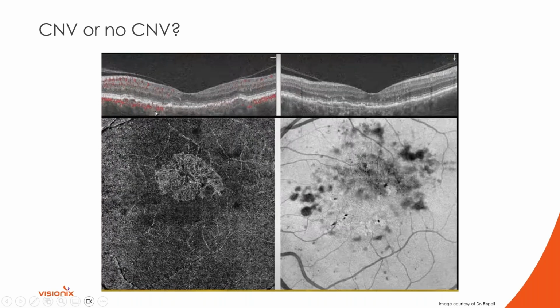And what we're appreciating here is these areas where the RPE is slightly lifted up. We're not particularly seeing any form of exudation. So this might be another example of one of those occult non-exudative membranes where there's stuff going on, but we certainly don't see a whole bunch of fluid in the surrounding area. Look over here how the RPE is very, very subtly lifted up. This here is Bruch's membrane.